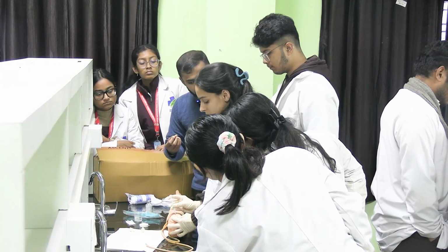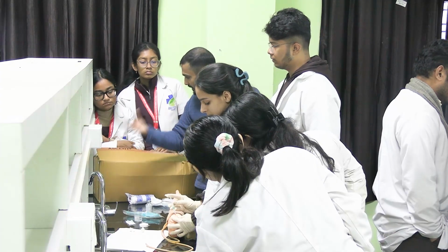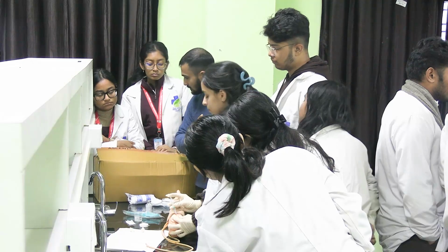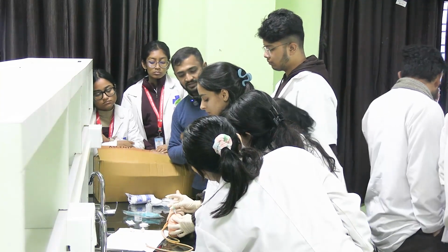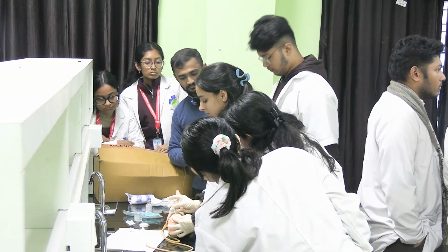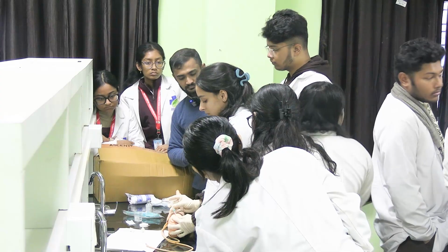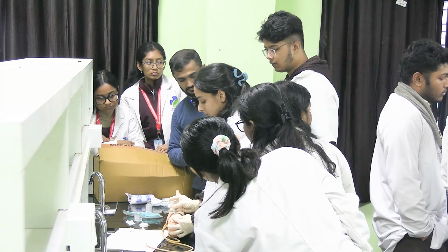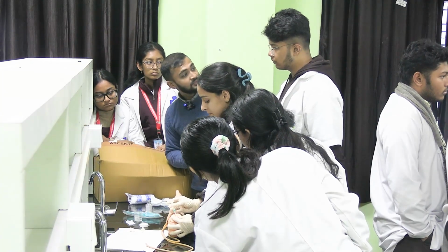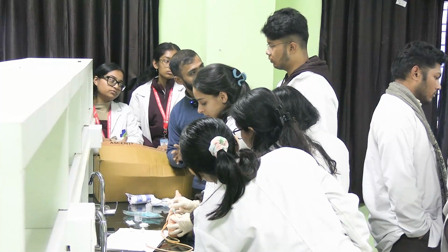If aspirated, yes, sir, blood came. If blood comes, then the same procedure, the same on the other side, with a difference: new needle, new site. Discard the old needle. Then inject it. This has to be complete, and the injection has to be slow, 30 seconds to 2 minutes. Okay.